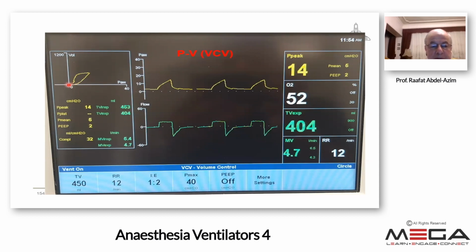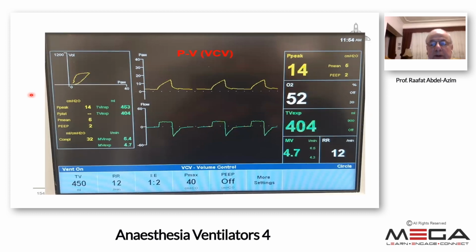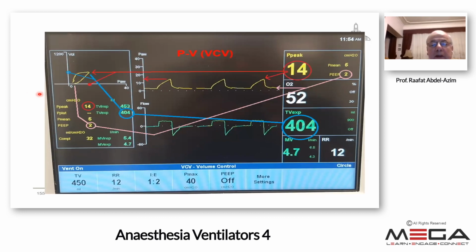from the starting point, which is not 0 because there is PEEP, so it will be slightly to the right side. Starting point of 0, pressure is not 0, it is +2. Then it will go up and right with increasing pressure and volume, and will go again to the left during expiration. The video will display it clearly. Before reaching the video, I will have some correlation.